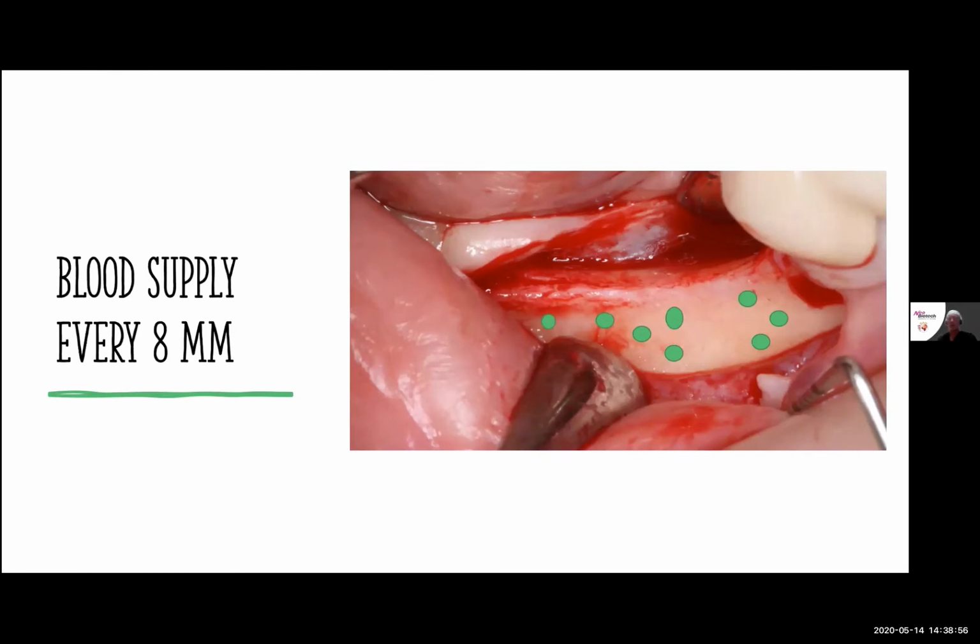But what I don't want you to think of is just doing a pinpoint area. I also want you to consider that I could remove a longer area with my round burr, or I could connect areas like this. By doing this particular type of opening, we have now created a large space for blood supply to come in.